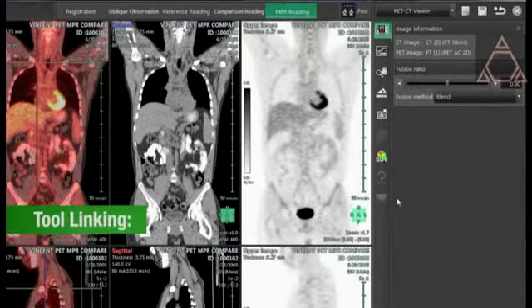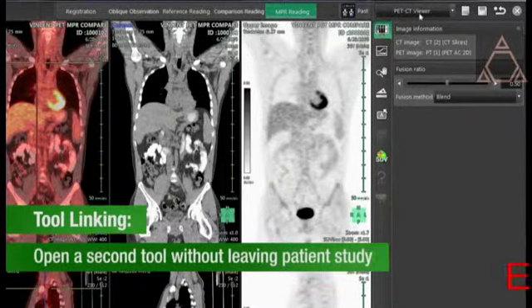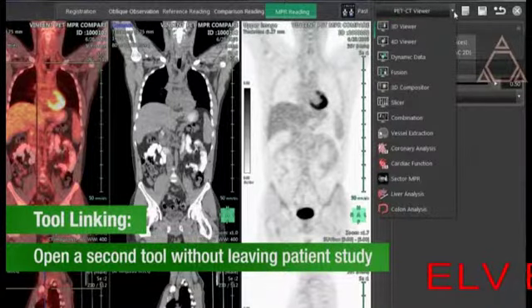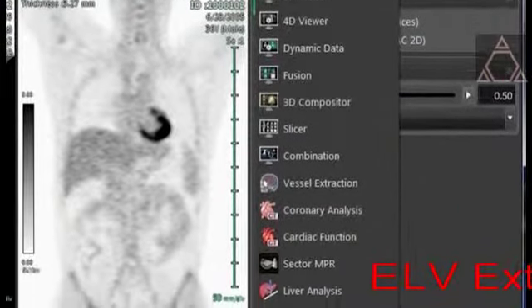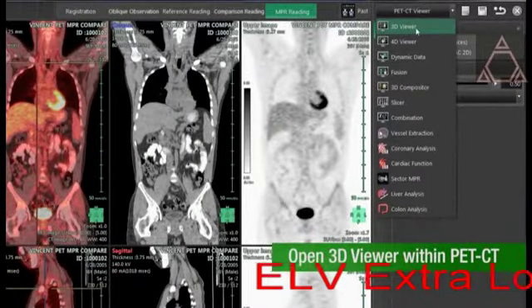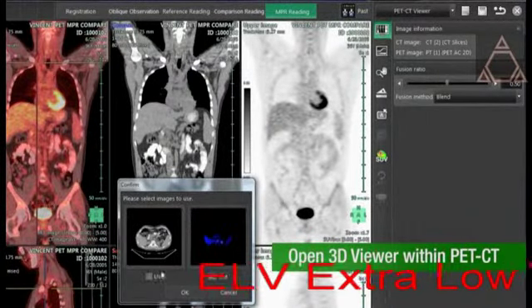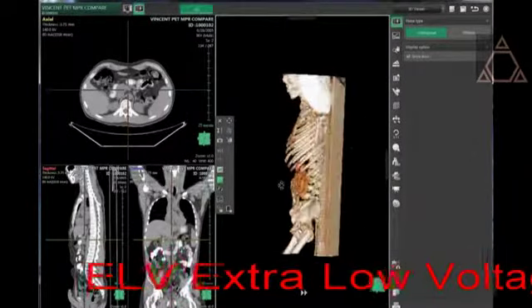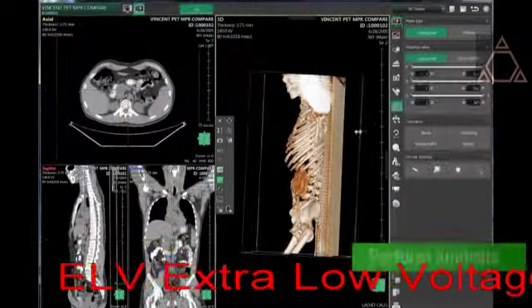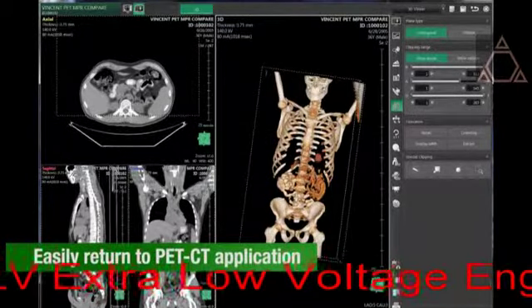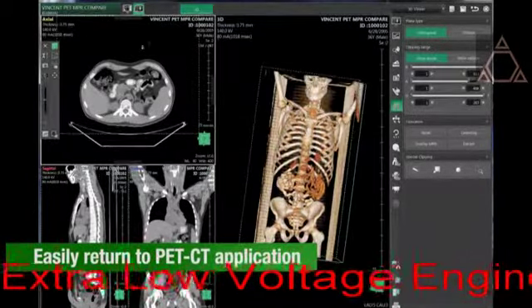Tool linking can speed your workflow. With tool linking, you can open a second tool without leaving the patient study. The drop-down menu displays the tools you can directly link to at any time. For example, from the PET-CT application, you can bring a CT scan into the 3D viewer to investigate an area of interest. Perform analysis within the 3D viewer and easily return to the PET-CT application with one click.